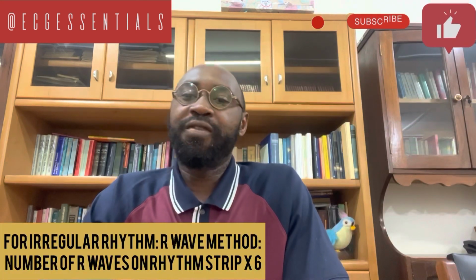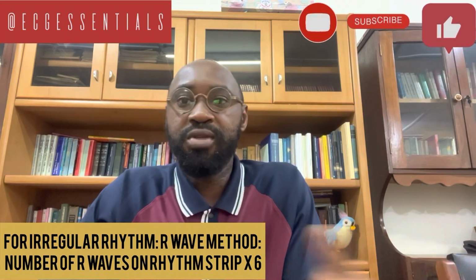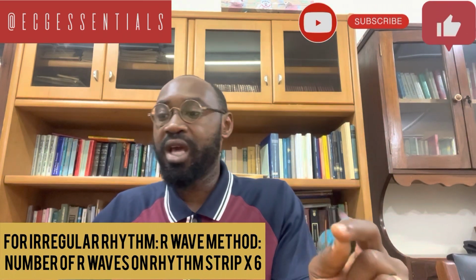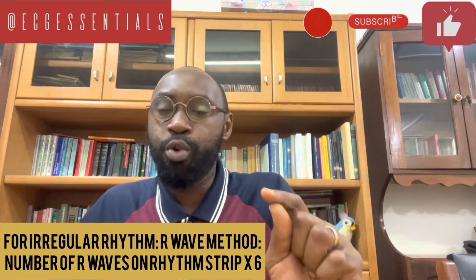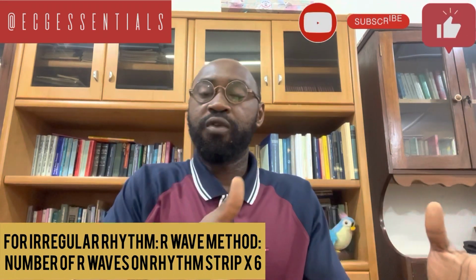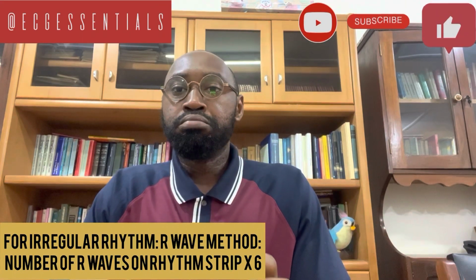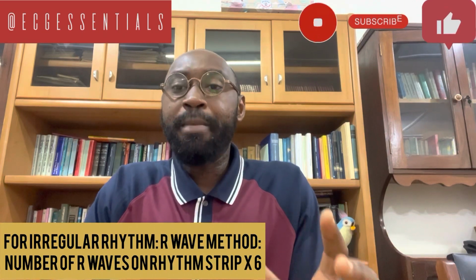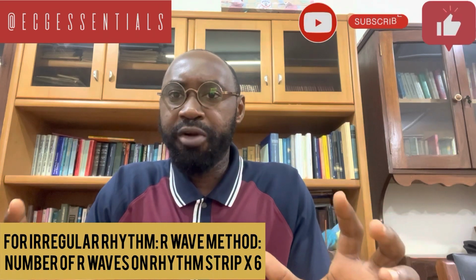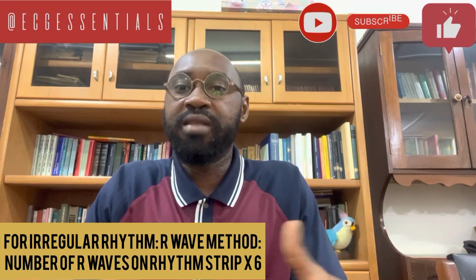However, if the rhythm is irregular, then we may not be able to easily use this method. Then we have to use the R-wave method. In this method that we use for an irregular rhythm, we simply multiply the number of QRS complexes found on the rhythm strip by 6.